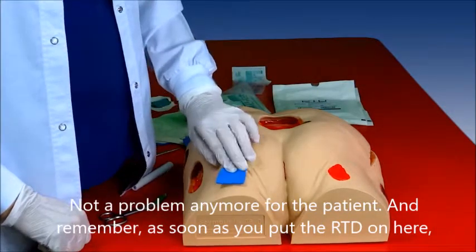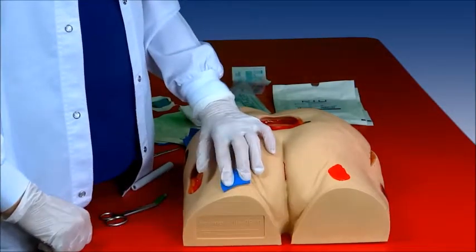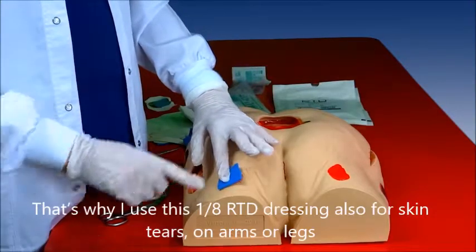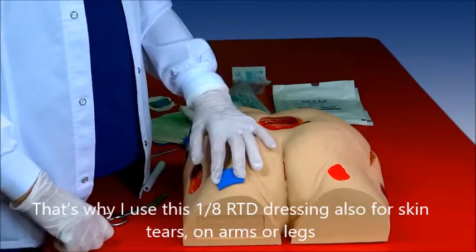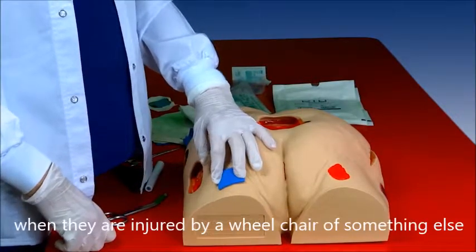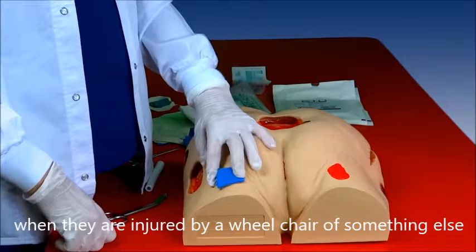Remember, as you put the RTD on here, the pain is going to go away, and that's a really added benefit. That's why I use this dressing — this one-eighth — also for skin tears on the arms or the legs if they occur when they're injured by a wheelchair or whatever.